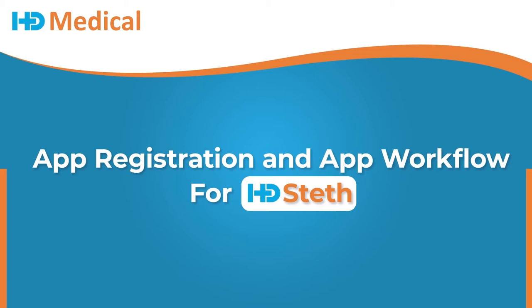For a normal launch, when the user selects the HD Steth app, either from the Google Play Store or the Apple App Store, the app will take you to the ECG guidelines screen. The app registration process for Android and Apple iOS.